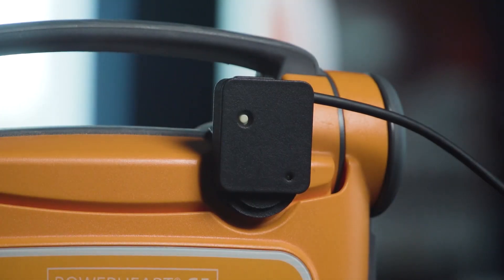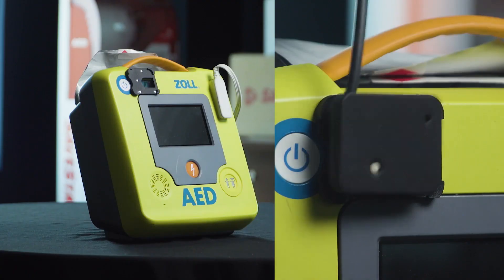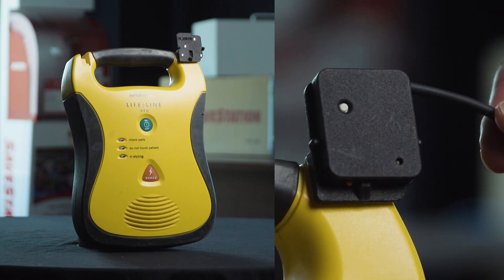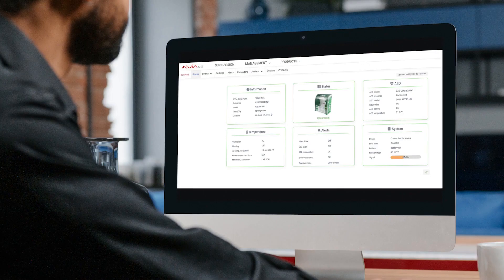This instructional video is to show the proper installation method of the save station's optical sensor. Once installed, this sensor will allow you to view the readiness and presence of the AED in real time on the monitoring platform.